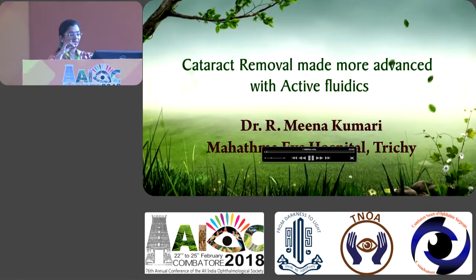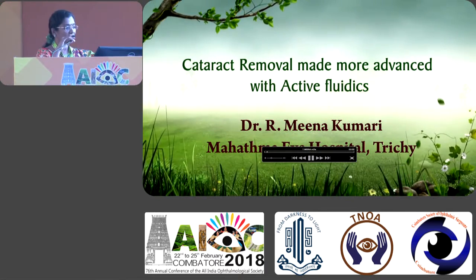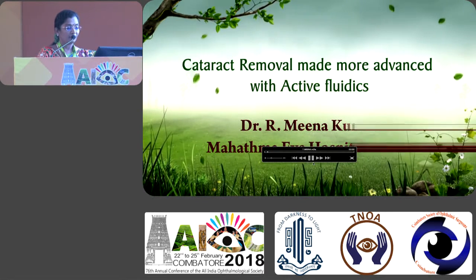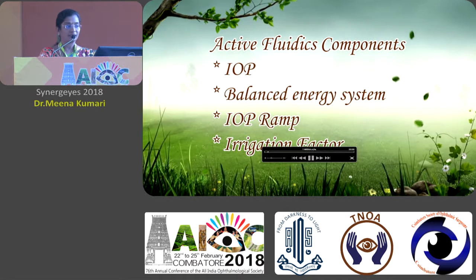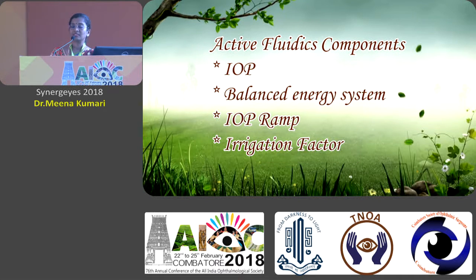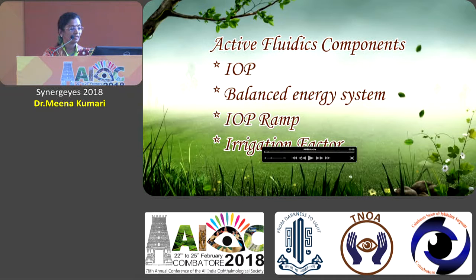So good morning, everybody. So what is new in removing cataract and what is active fluidics? I'd like to say a few words about what is active fluidics. You would have normally seen BSS hung in a pole from where the BSS is infused into the anterior chamber based on gravity, the flow running from a higher gradient to a lower gradient. But in active fluidics, the BSS is placed at a much, much lower level and into a bag-based system. Hence the name active fluidics.